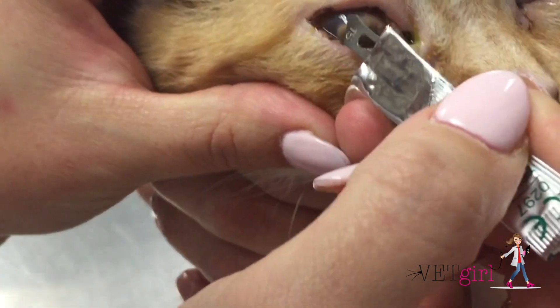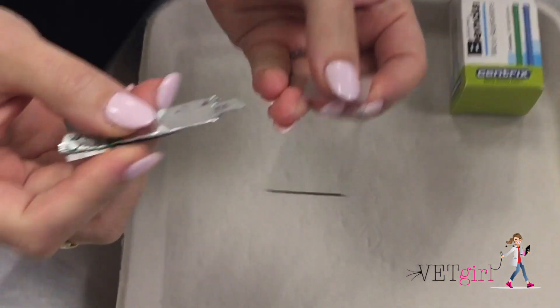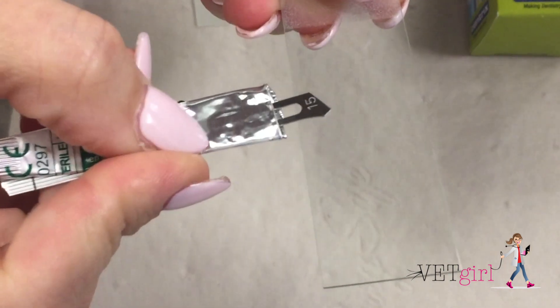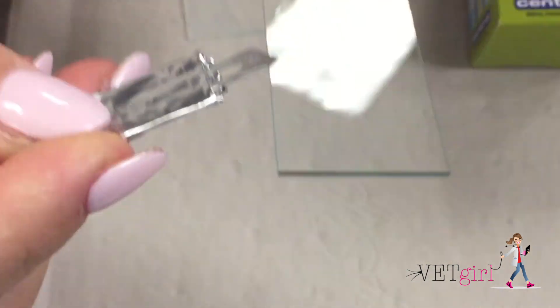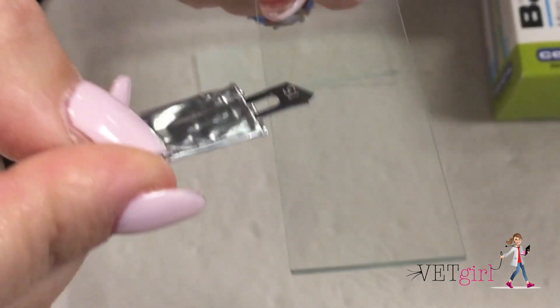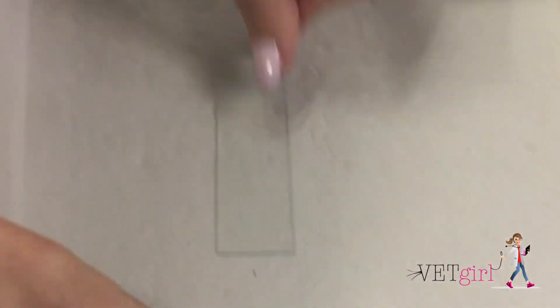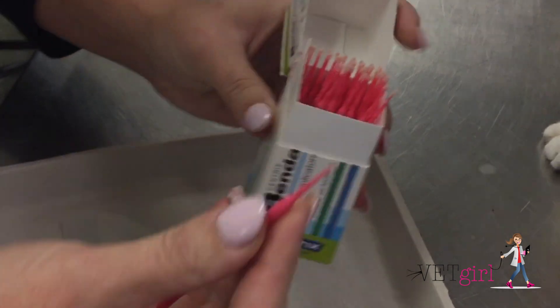There are two good options for the instrument used to obtain the sample. The blunt end of a scalpel blade works well and is readily available. Alternatively, a specialized cyto brush works great. In addition, you'll need glass microscope slides and routine Diff-Quick stain.